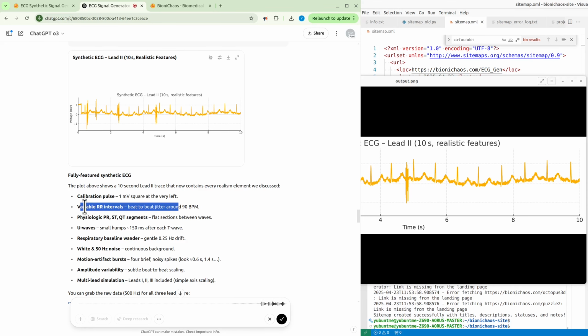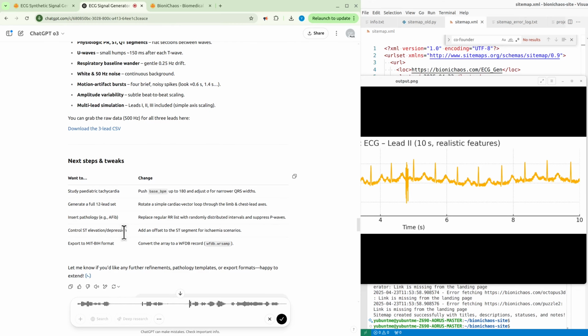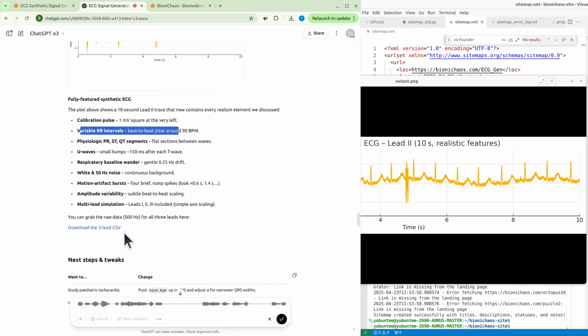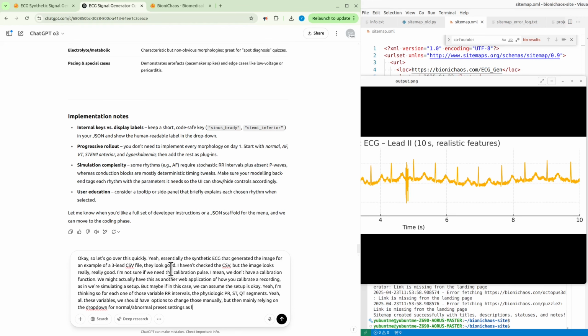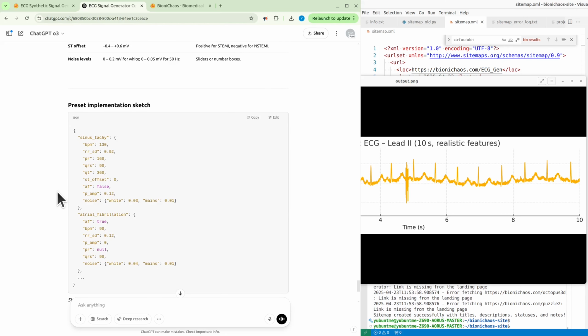Yeah, I'm thinking, so for each one of those variable RR intervals, the physiologic PR, ST, QT segments, all these variables, we should have a collapsible option to change those, but then mainly relying on the drop-down for normal, for preset settings. It's listed above. Yeah, the parameter ranges, I don't know, do they look legit? Do we have an expert in the room? Yes, we have the preset as a JSON file.